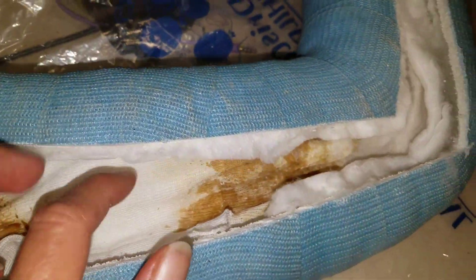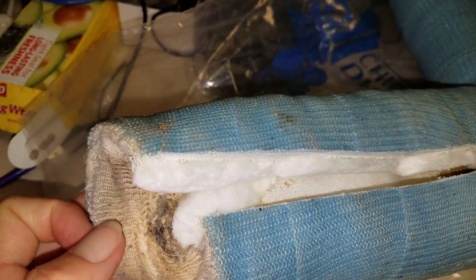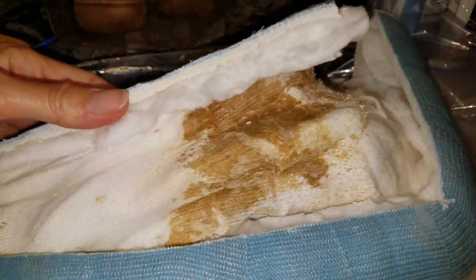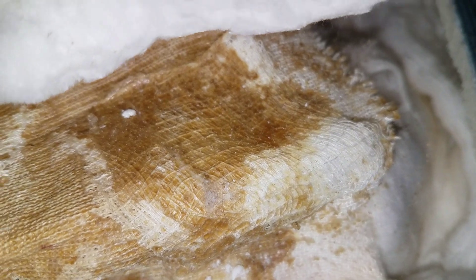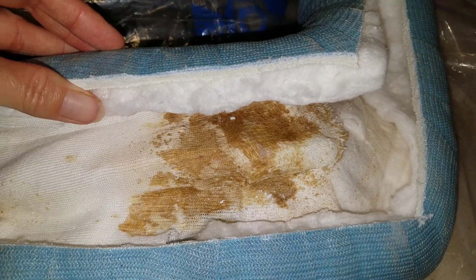And here inside you can see that was all her skin that got torn off because it had fused to the cast. Pretty gnarly. Pretty gross. Pretty bad. Very painful, very itchy and then very painful — like a burn, or worse. It really hurts, like a blister. You've had the skin torn off a huge part of her arm. Reaction to the cast — having a reaction to having it on there, with the fibers staying on her skin. And now that's the result. It ended up making her skin rashy and reacting, then sticking to it, and then pulling it all off after three weeks of it being on there.